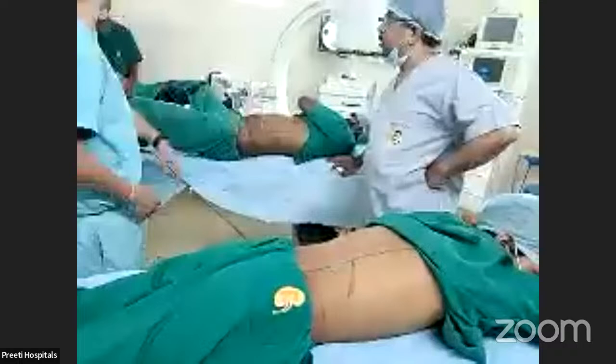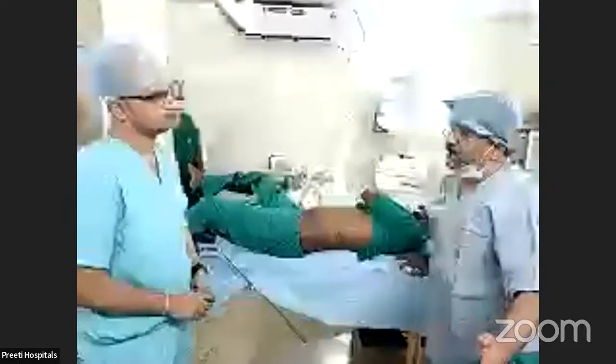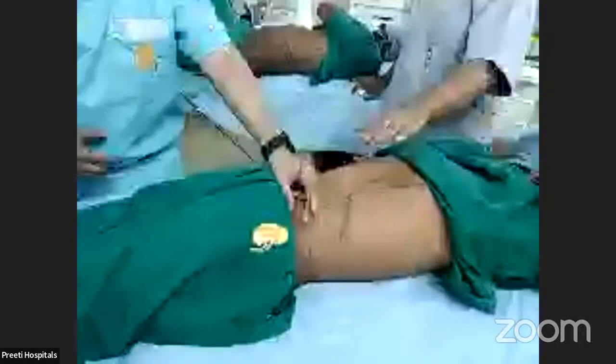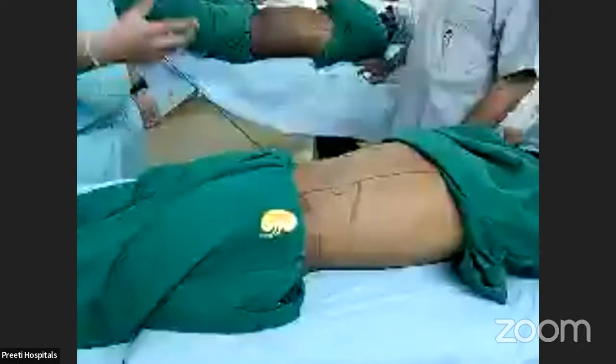Yes, scenario number one, a pelvic stone, large or small. We can approach from the lower calyx. So in prone, normally which calyx do you prefer? In prone position, the patient lies flat. If there is a stone in the pelvis, will you prefer the inferior calyx, middle calyx, or upper calyx in prone? Inferior calyx or middle calyx.